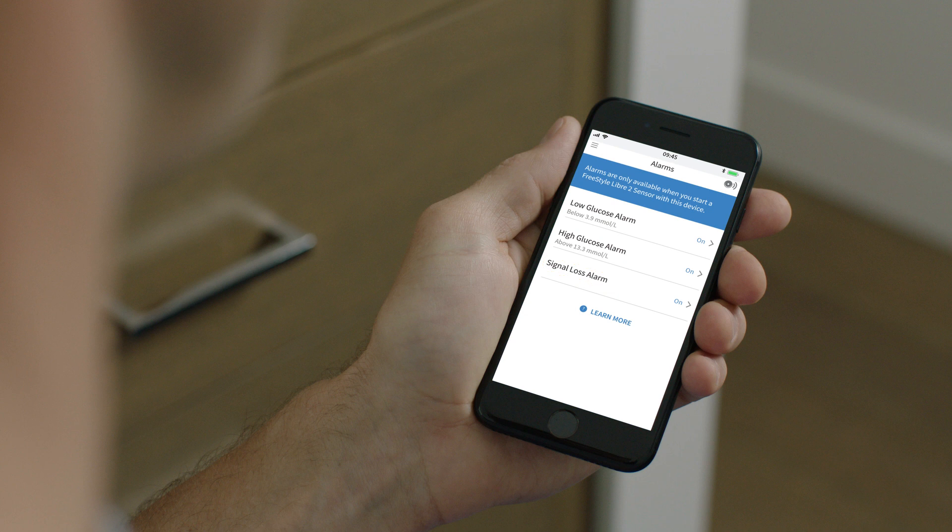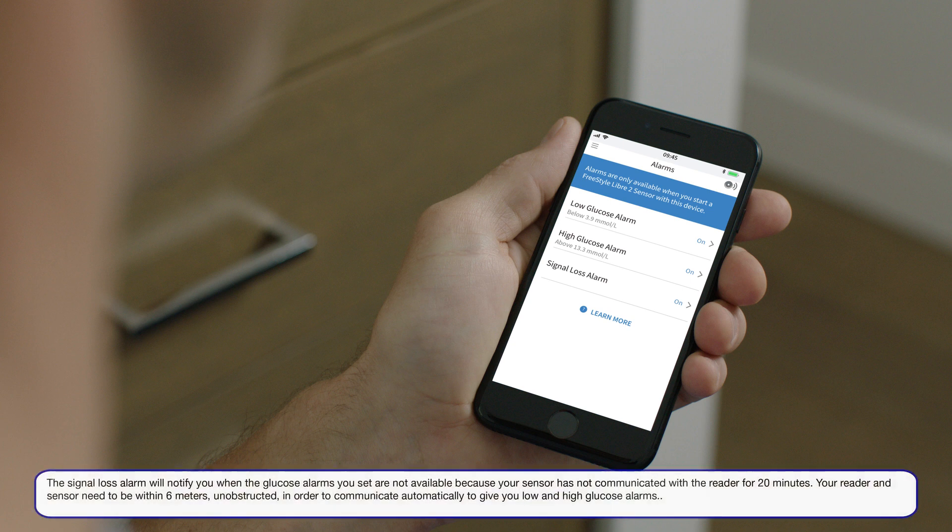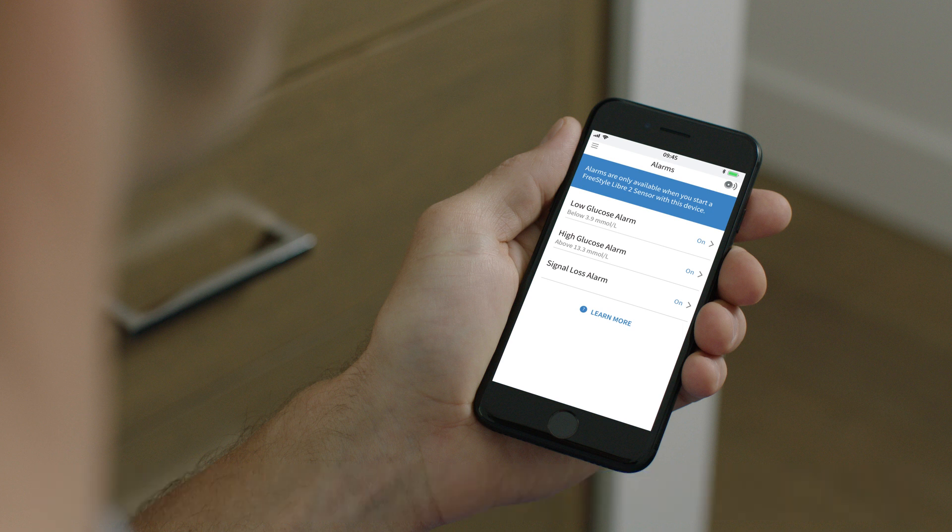These will be automatically set to on when you first open the app. Whenever the low or high glucose alarms are turned on, check to ensure your signal loss alarm is also turned on. The signal loss alarm lets you know when your sensor is not communicating with your phone.